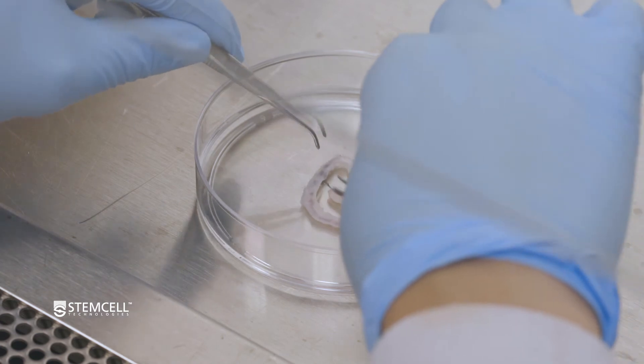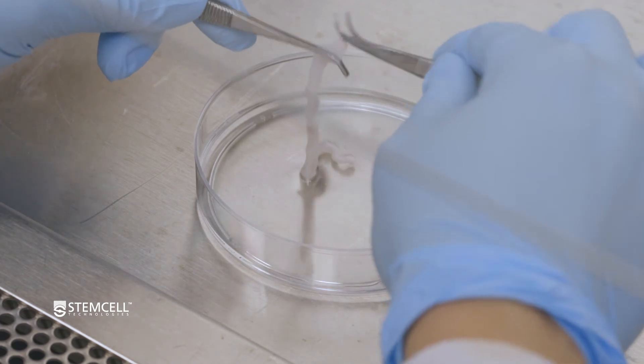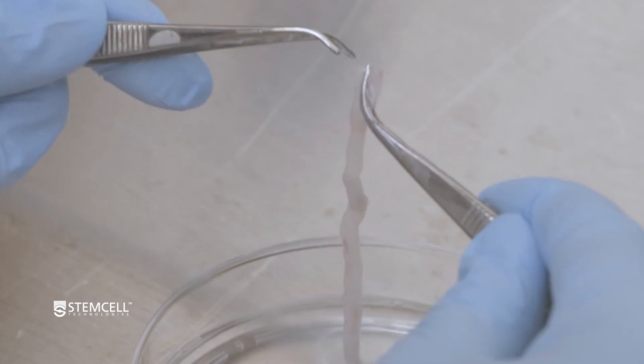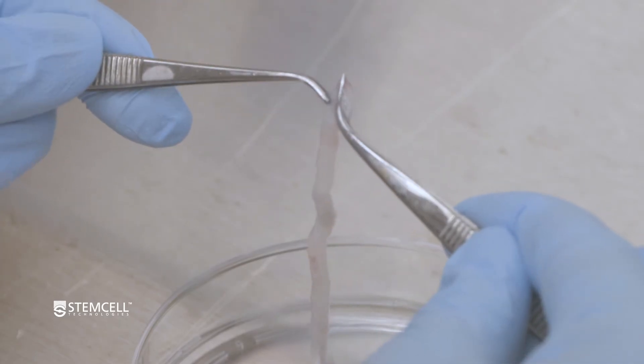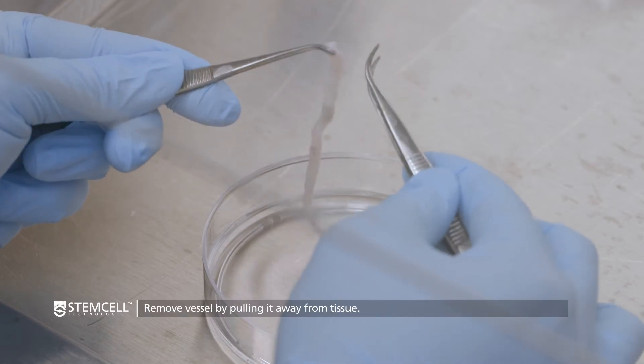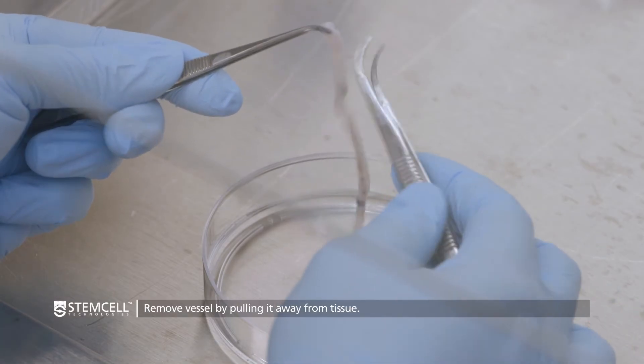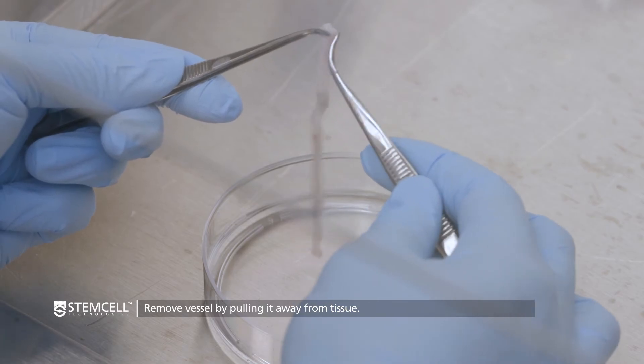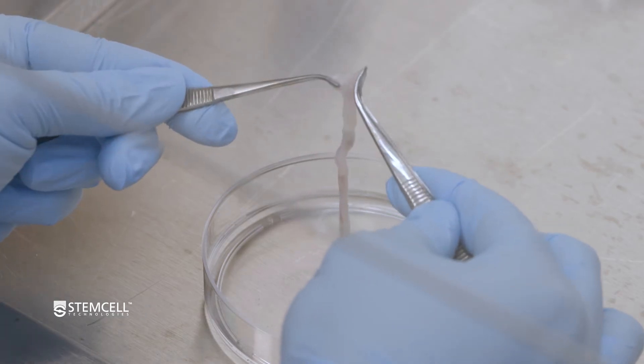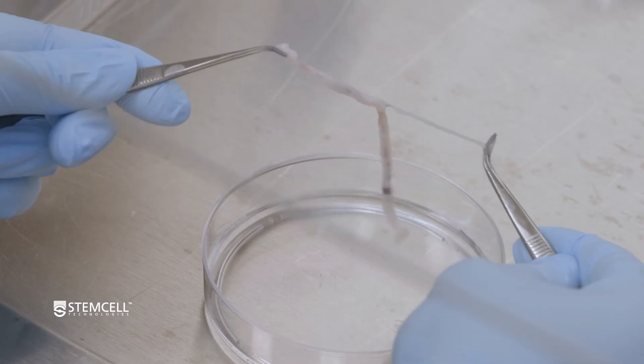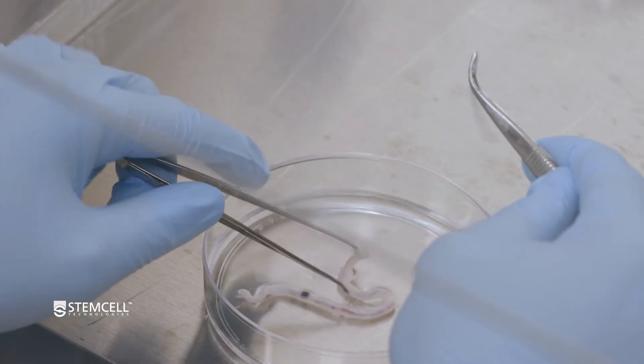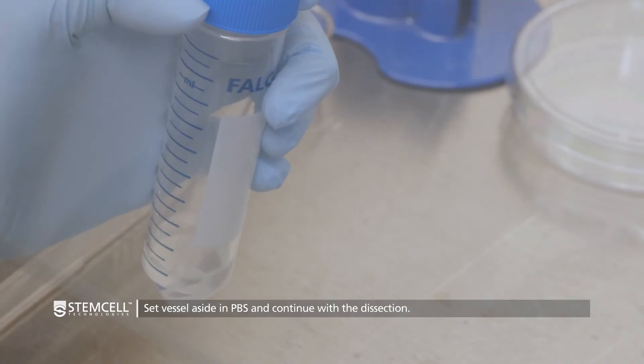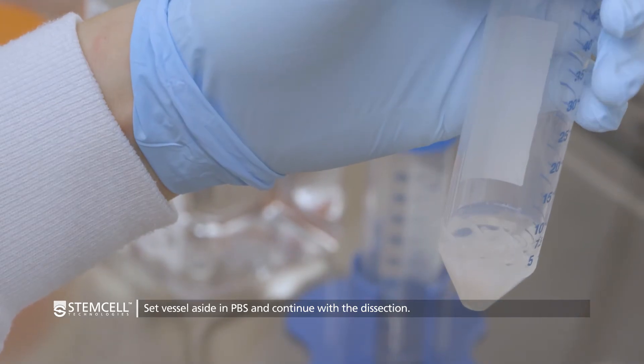Strip the perivascular Wharton's jelly from the vessels by tightly gripping the opaque or white tissue with one forcep, while holding the vessel with another forcep in the other hand. This tissue should easily pull away from the vessel. The vessels are quite fragile. Be careful not to pierce the endothelial layers in order to minimize contamination with endothelial cells. Set the tissue strips aside in PBS while all of the vessels are stripped. Discard the bare vessels.